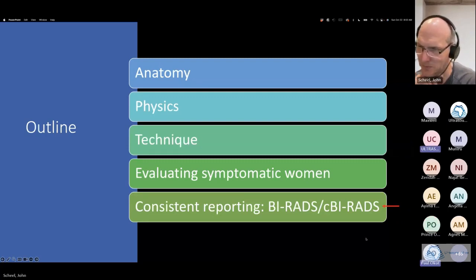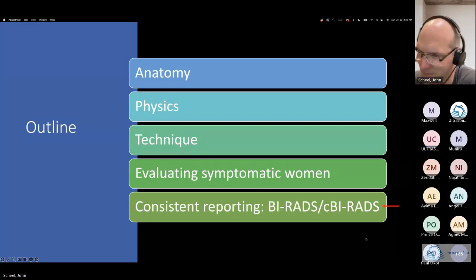Okay, thank you. Emmanuel is asking. No, you're welcome, Paul. Yeah, Emmanuel is requesting more elaboration on axial and lateral resolution and its applicability.